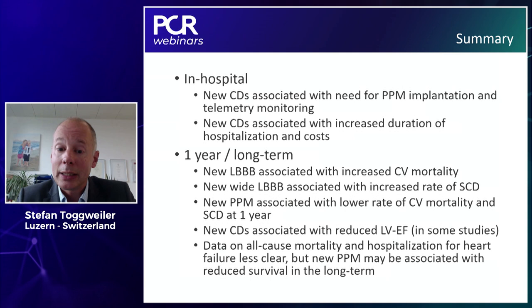A recovery of LV ejection fraction was reduced in patients with conduction disorders. And overall data on all-cause mortality, and also on hospitalization for heart failure, is a bit conflicting. It's not crystal clear at the moment, but in this large UK study, at least there was a trend or borderline significance that the pacemaker may be associated with reduced survival in the long term. So I think there is still room for research here.